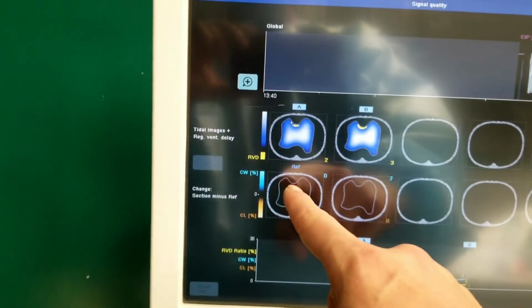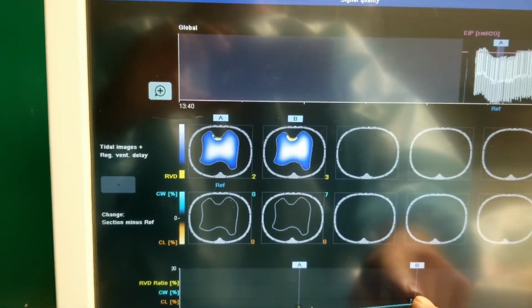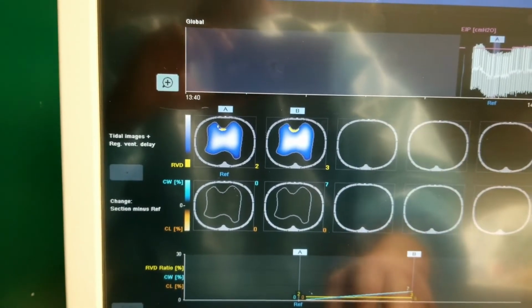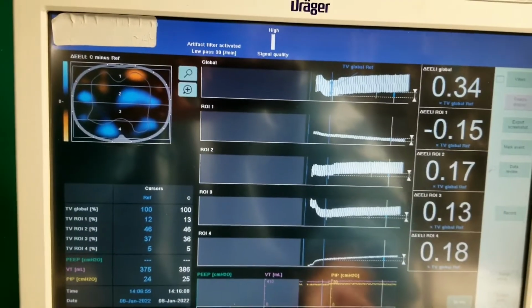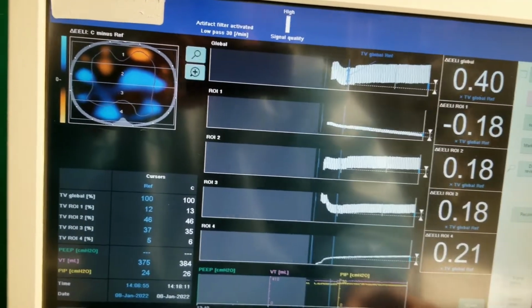So from going from 24 to 25, we have a slight improvement of 7%, so the lung's a little bit more compliant. So we'll do that in about an hour. Okay. All right. So we went from 24 to 25. We're only looking at the moment to about 12 minutes in.